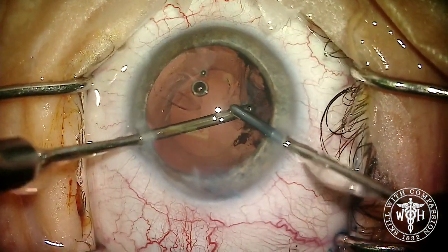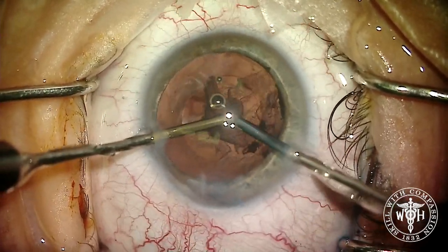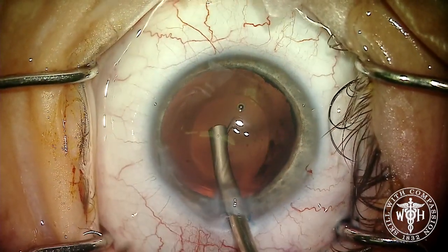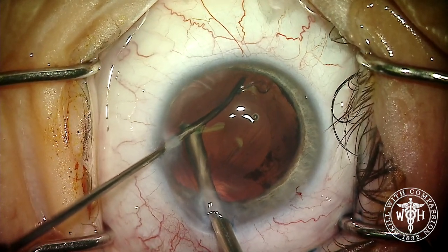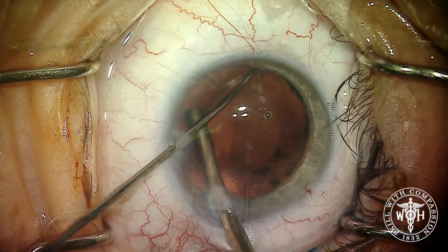Bimanual I/A is used for all complex cases to remove the cortex. After cortical cleanup, the next step is placement of the capsular tension ring. Every patient who gets a synthetic or artificial iris also gets a capsular tension ring, to keep that capsule wide open and prevent any capsular phimosis.